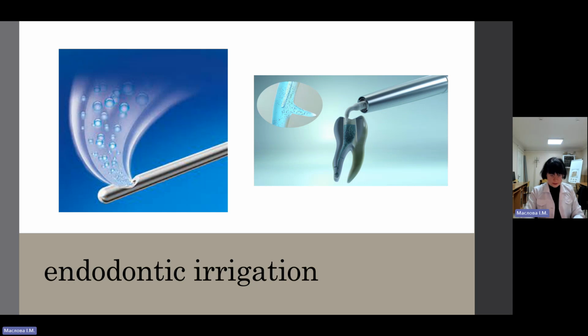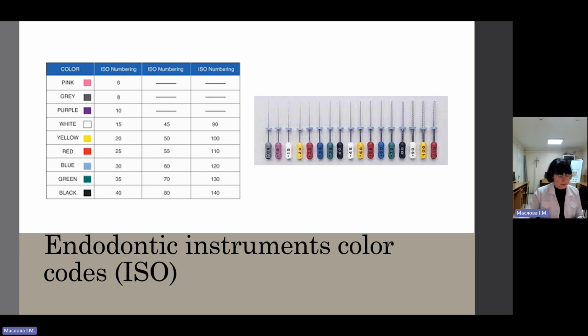Canal preparation. Several methods of canal preparation exist. The method described here is the current one. Canal exploration, pre-enlargement when necessary, straight line radicular access, working length determination, and apical third preparation. These are the main stages of root canal preparation.